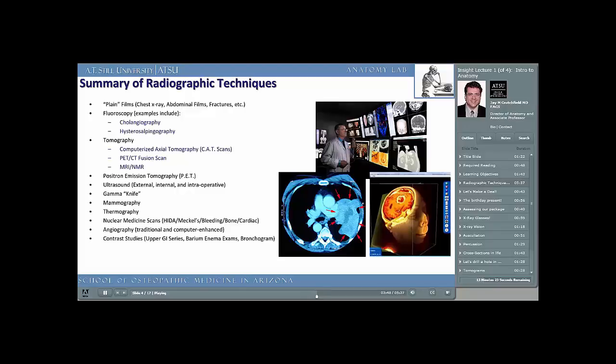Barium enema examinations are still used today to look at the lower intestine and even the upper intestines. Barium sulfate is allowed to flow from the anus and rectal area into the colon, using fluoroscopy to get an image of the entire colon.